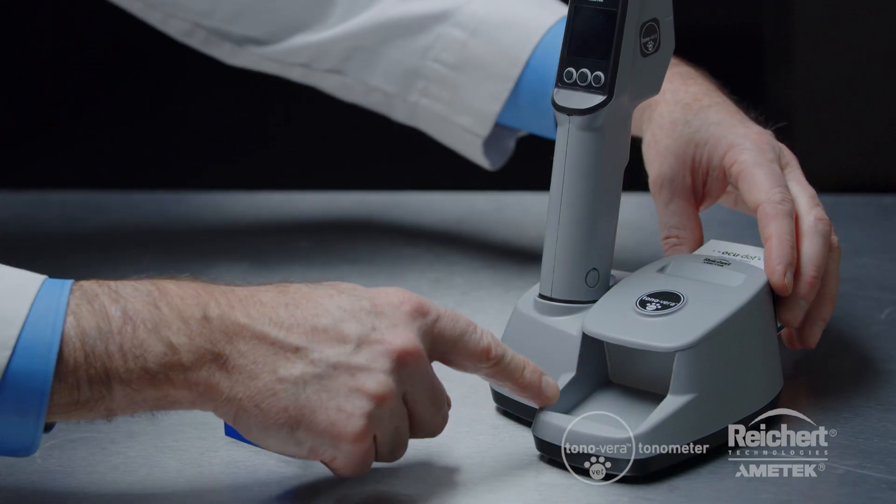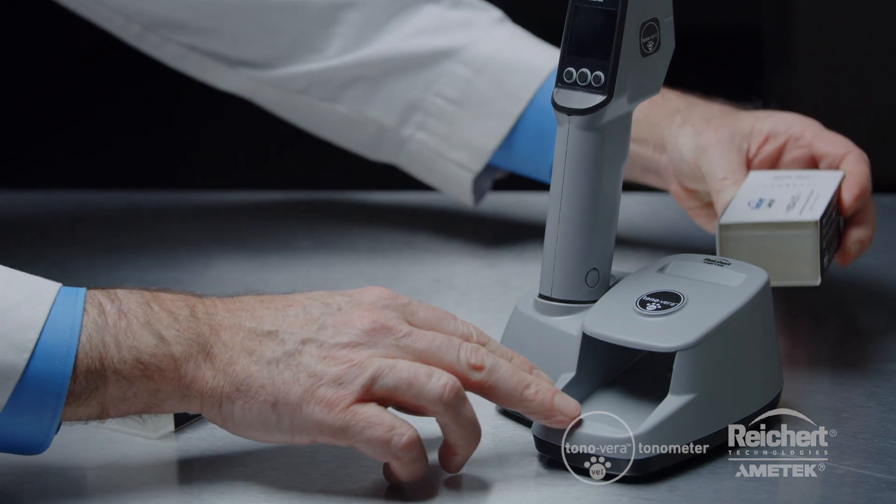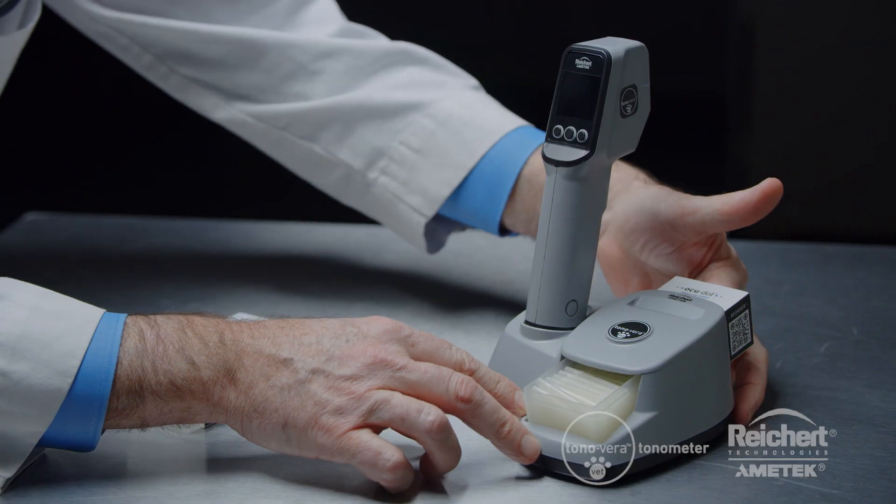To install the box of probes, simply open the box and lay the flap along the side. Install the box with the tray facing forward, then push the tray all the way to the front.